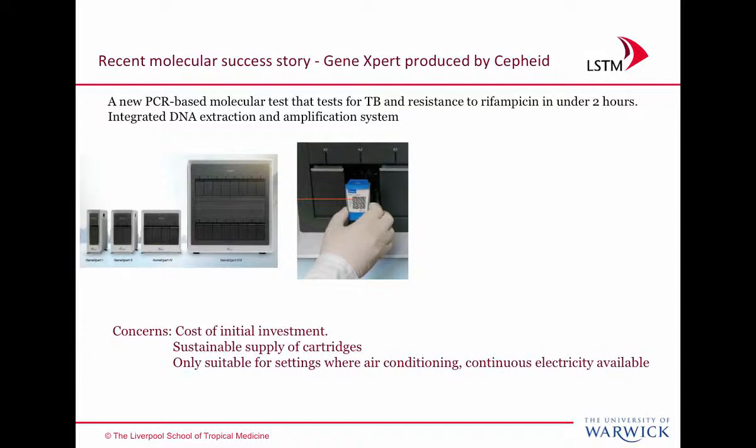and now they have multiple cartridges for MRSA, HIV, TB, syphilis, but they're not going to make it an open platform. They're not going to say, have you got your own primer sets, we'll introduce them to a new cartridge. So it won't be available, at least in the near future, for VL, for trypanosomiasis, for malaria even.